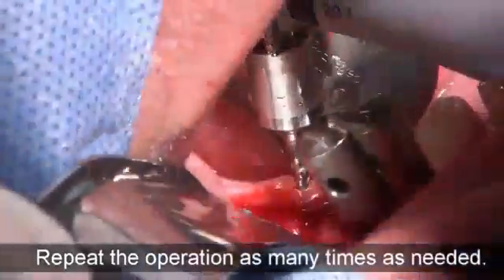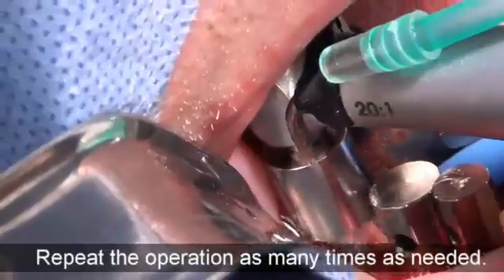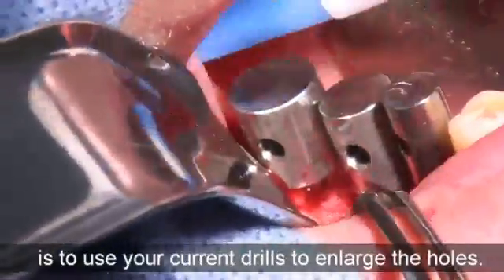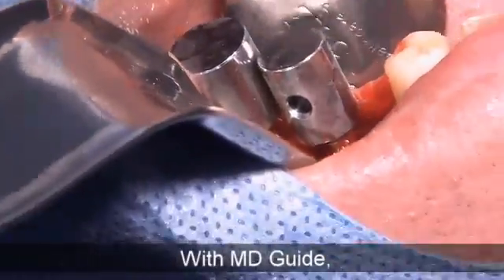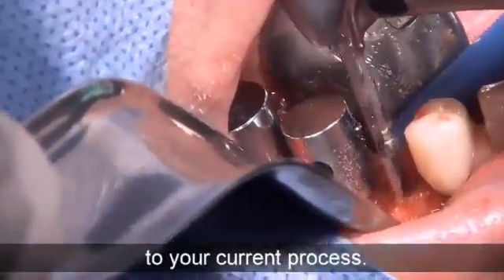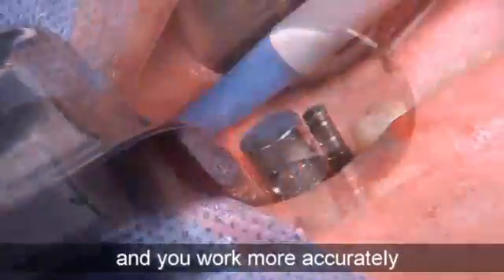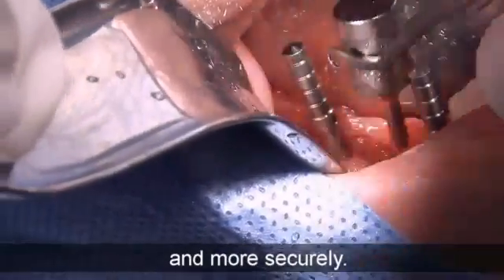and use it now as if it was a real tooth. Repeat the operation as many times as needed. All you have to do is use your current drill to enlarge the holes. With MD Guide, you don't have to change anything to your current process. You don't need any surgical guide, and you work more accurately and more securely.